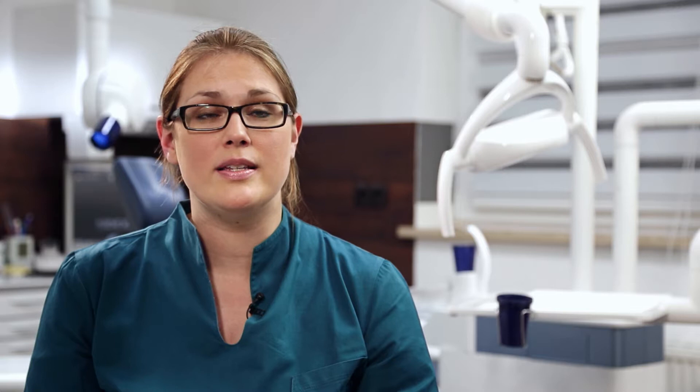Positioning in the Orthofis SL works like a charm. In fact, positioning the patient is almost automatic with the new occlusal bite block.